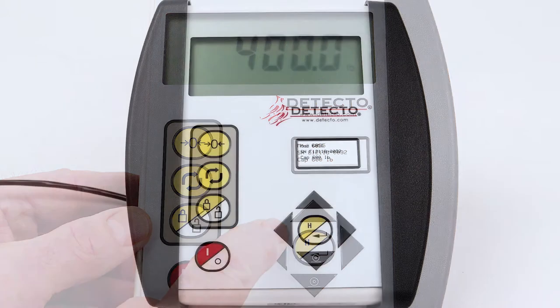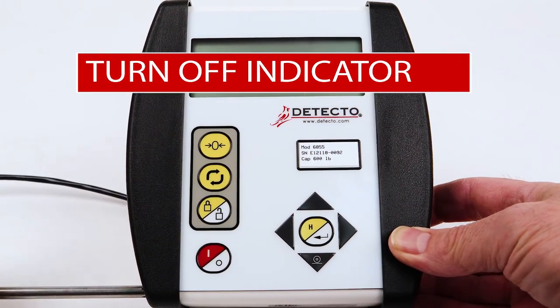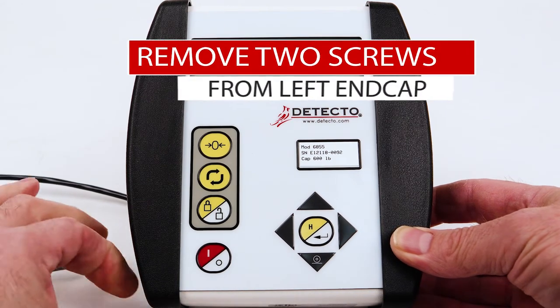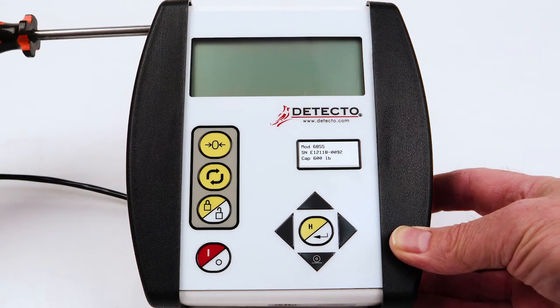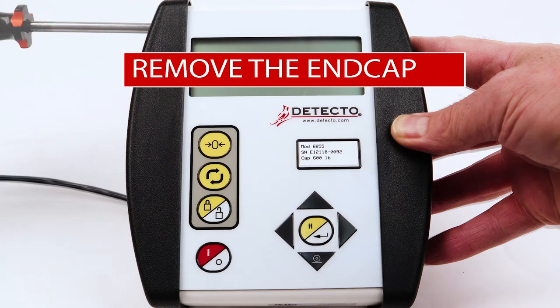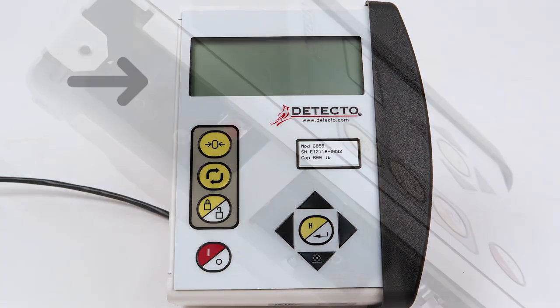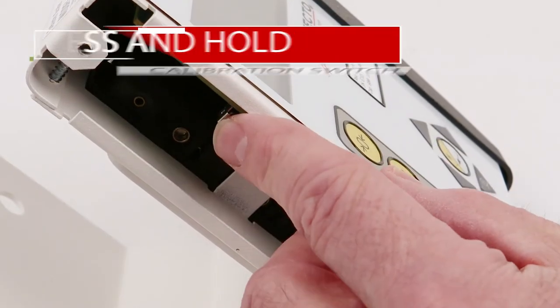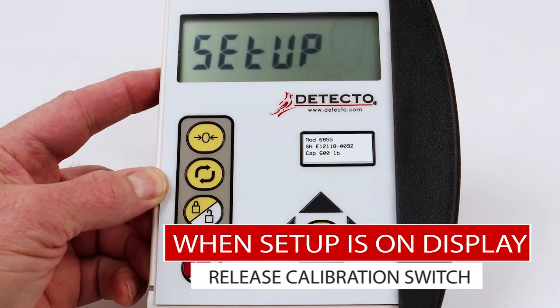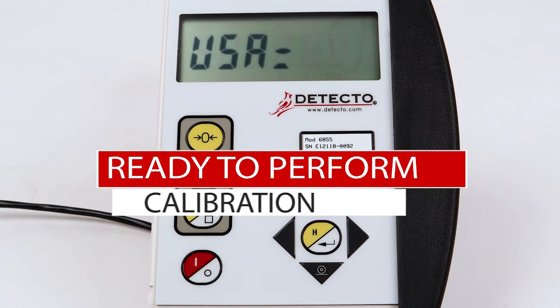To begin calibration and setup, make sure the 750 indicator is turned off. Next, looking at the front of the 750, remove the two screws from the left end cap. Remove the end cap and locate the calibration switch near the upper portion of the front panel. Press and hold the calibration switch and turn the 750 on. When the display changes to show SETUP, release the calibration switch. You are now ready to perform calibration.